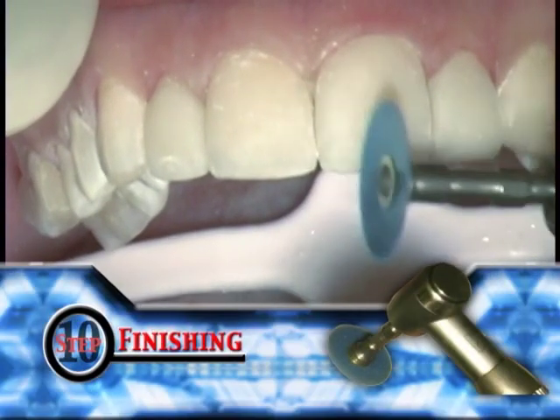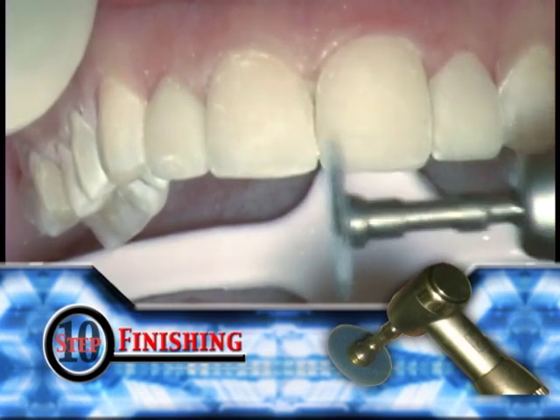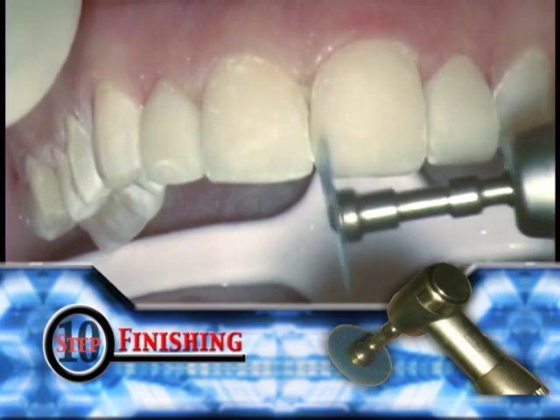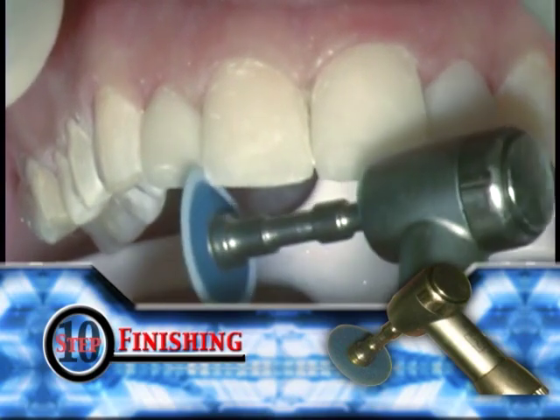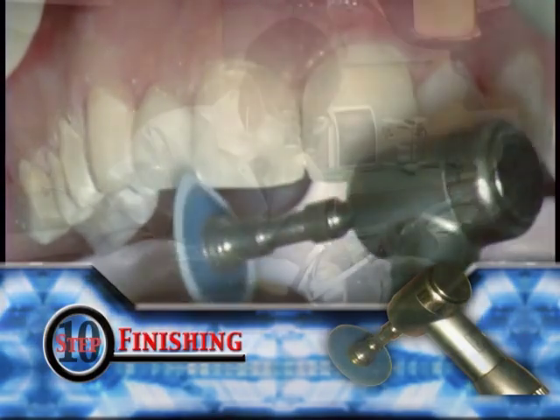Now our doctor uses a common sandpaper disc on his drill to round out the corners. The disc he is using is a Flexi Blue disc manufactured by Cosmodent. He will round corners slightly more for women and less for men.